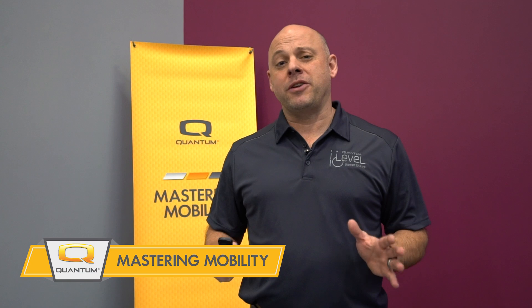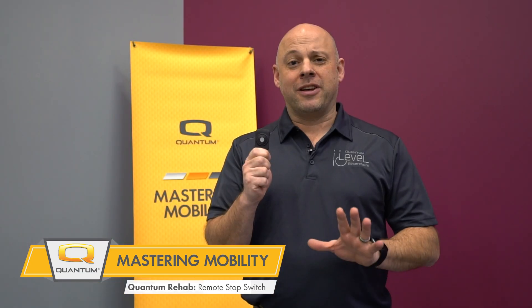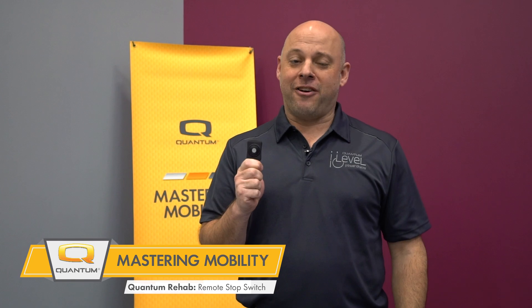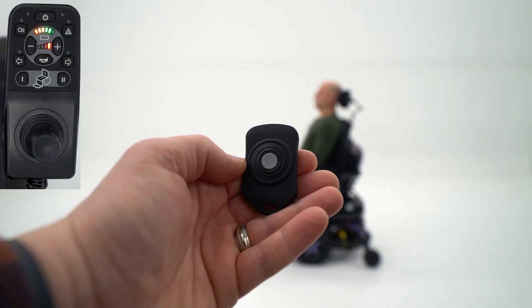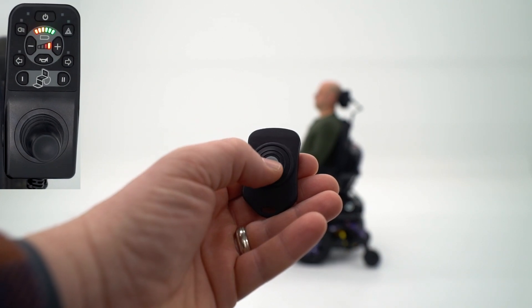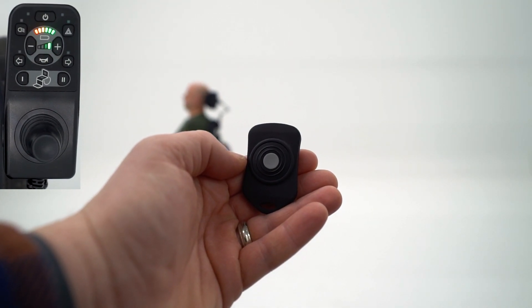Quantum Rehab is adding a great new tool to our product lineup. It's a remote stop switch, and we'll tell you all about it in this edition of Mastery Mobility. The Quantum remote stop switch is designed to be used as a training tool that can help new power chair users familiarize themselves with their seating system and navigate confidently.